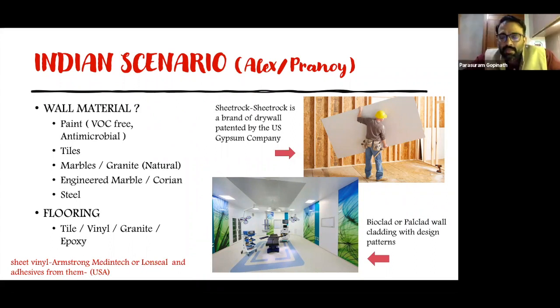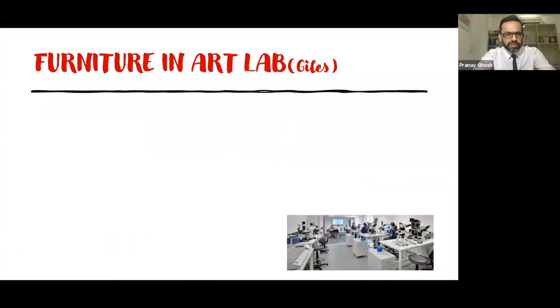Pranay, do you want to add something, or can I go to the next question? Just that whatever you use, it should be VOC free, it should be easy to clean, and it should not off-gas. That's it. So the things that you have enumerated are the ones that are commonly used.